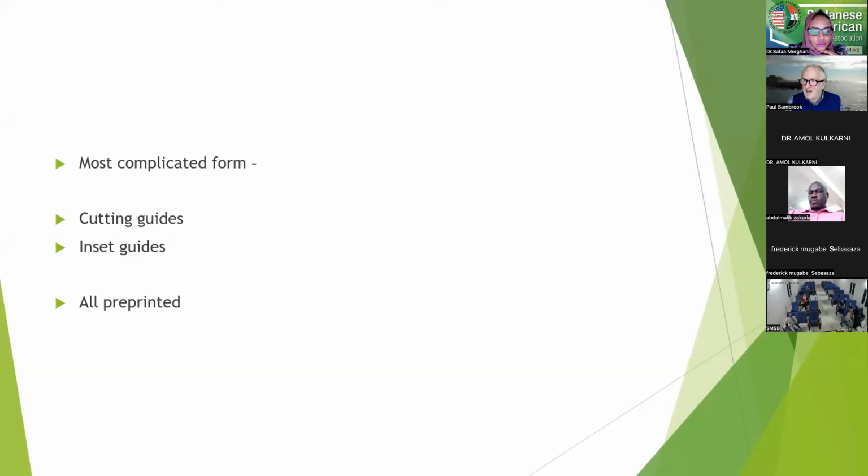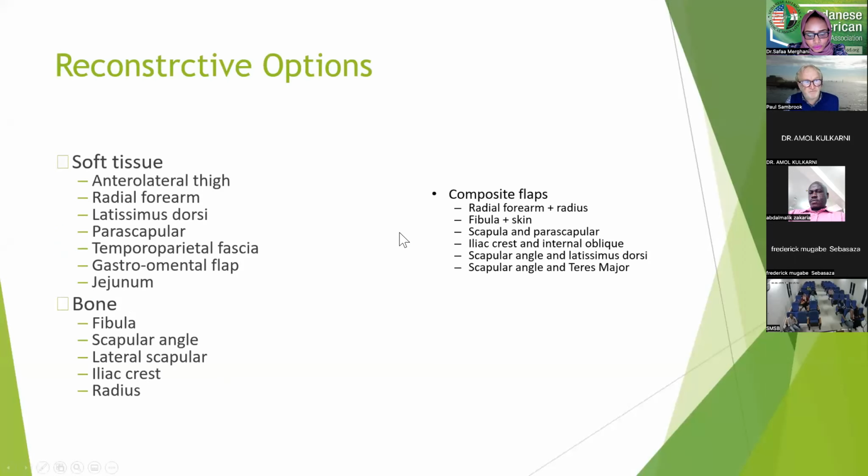So you need to be able to perform the reconstruction without the need for a guide if things happen, and things will happen more often with oncology than they will with orthognathic surgery. With oncology, the tumor may have grown. The soft tissues or the blood vessels may not be exactly as you had planned. You may find that there's a fracture in your graft that you weren't aware of. You may find that all sorts of other things can happen that make this even more complicated than it could have had before. So these are the reconstruction options that we use within our department here.